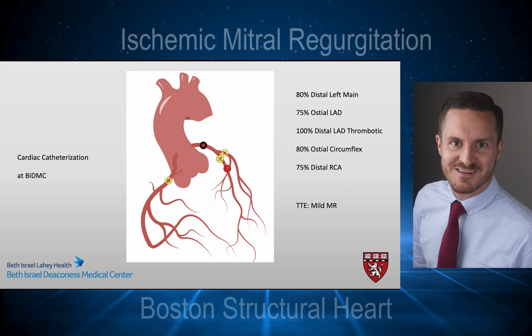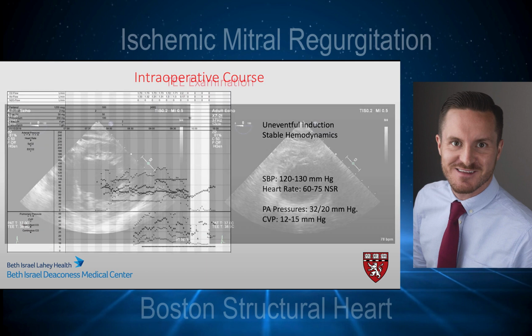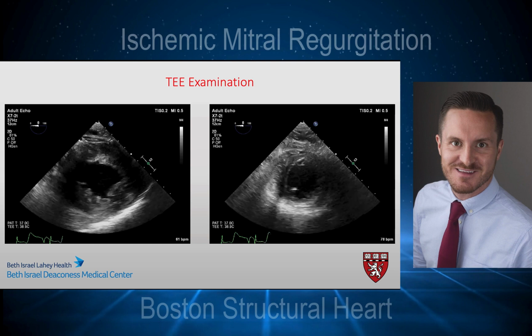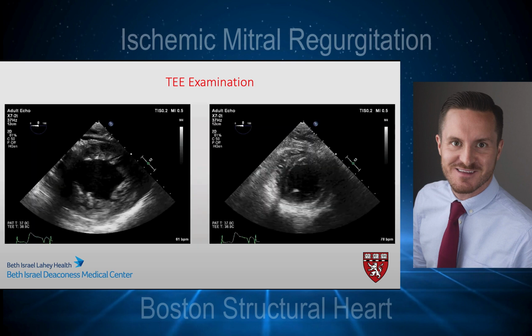Of note, preoperative transthoracic echo demonstrated mild mitral regurgitation. He presented to the operating room for his coronary artery bypass surgery and underwent uneventful induction of general anesthesia. We performed a baseline transesophageal echocardiography, which showed moderate LV dysfunction with a global hypokinesis and also an akinetic apex.